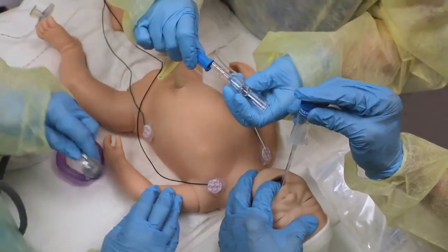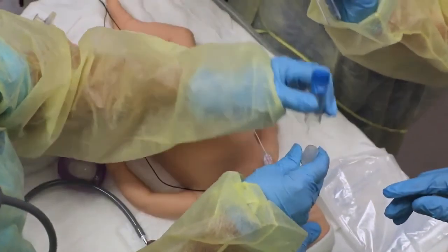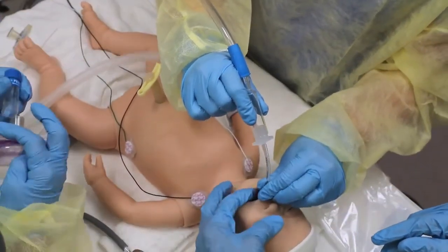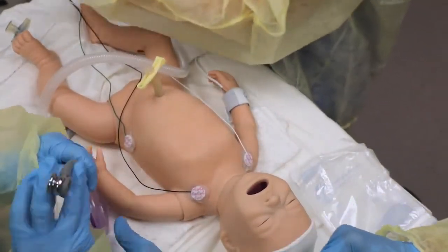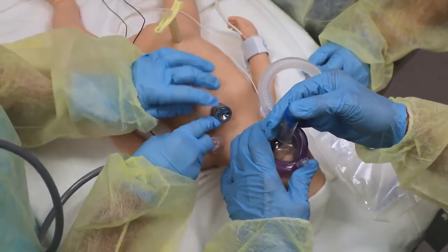Connect a meconium aspirator to a suction source set at 80 to 100 millimeters mercury. Connect the aspirator directly to the ET tube connector or to the integrated suction port if your ET tube is equipped. Occlude the suction control port on the aspirator with your finger and gradually withdraw the ET tube over 3 to 5 seconds. Resume face mask PPV or quickly re-intubate.